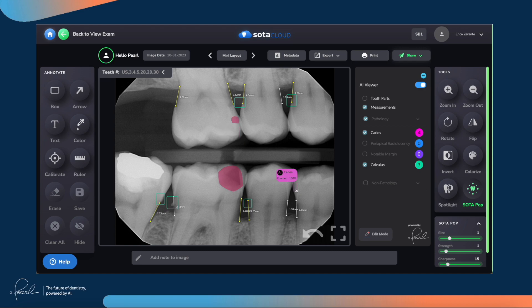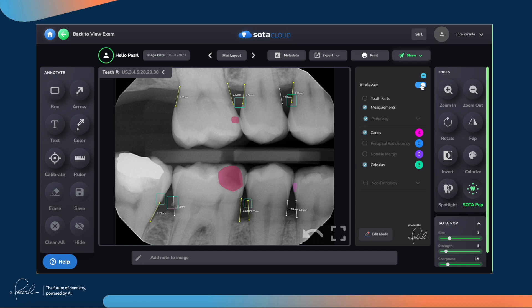The same is true with incipient lesions, although these will almost invariably show just 100% into enamel. On the right-hand side, if you want to view the x-ray without any AI detections, you can simply toggle off the AI viewer and you'll see the radiograph without any detections whatsoever. This is useful to validate the AI's detections or simply to show the patient what their x-ray looks like without the AI information guiding their understanding.